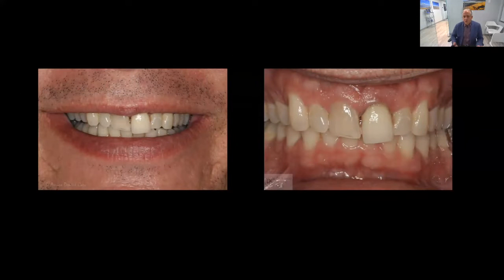And let's look at this case. Low lip line, plenty of keratinized tissue. This patient was having an issue with tooth number 9. So again, this is a case where I would consider extraction and, if conducive, immediate implant placement if possible.